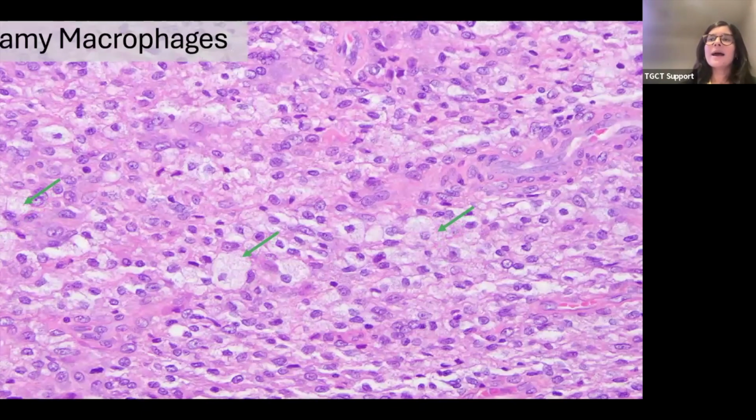In other areas, you may have more of the tissue being overrun by the macrophages, and the macrophages take on a few different looks. So here's what we call when they're foamy. The role of macrophages in your body is that they're a scavenger cell. They essentially are just engulfing debris, clearing it. And when they engulf anything that is lipid laden, their cytoplasm tends to accumulate those lipids, and that's what we call that foamy look. Again, a very generic description, but in certain areas of the tumor, you might see an overrun of foamy macrophages.